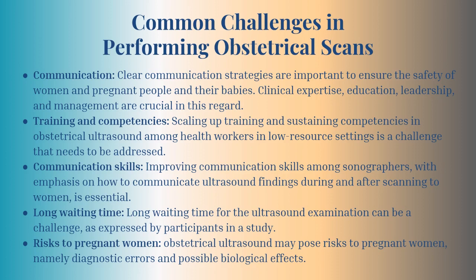Communication skills. Improving communication skills among sonographers, with emphasis on how to communicate ultrasound findings during and after scanning to women, is essential. Long waiting times for the ultrasound examination can be a challenge, as expressed by participants in a study. And risk to pregnant women. Obstetrical ultrasound may pose risks to pregnant women, namely diagnostic errors and possible biological effects.